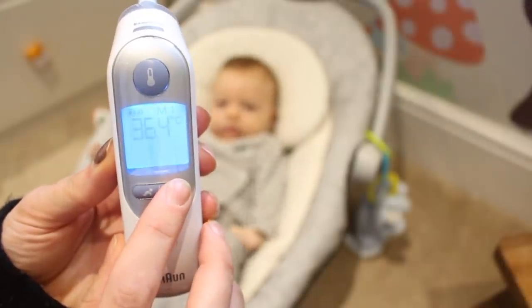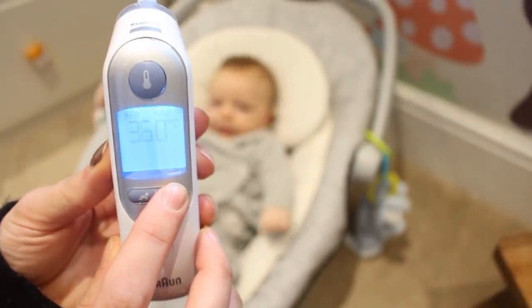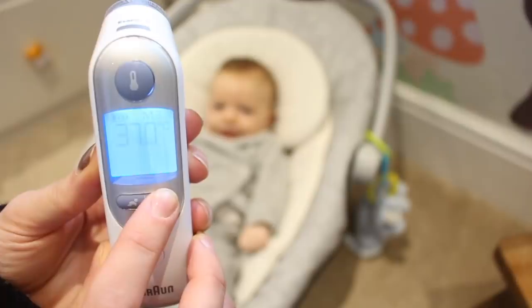What's really handy is that the Thermoscan 7 stores the last nine temperatures, so if your doctor does need to know the history of your baby's temperature, you've got it to hand.